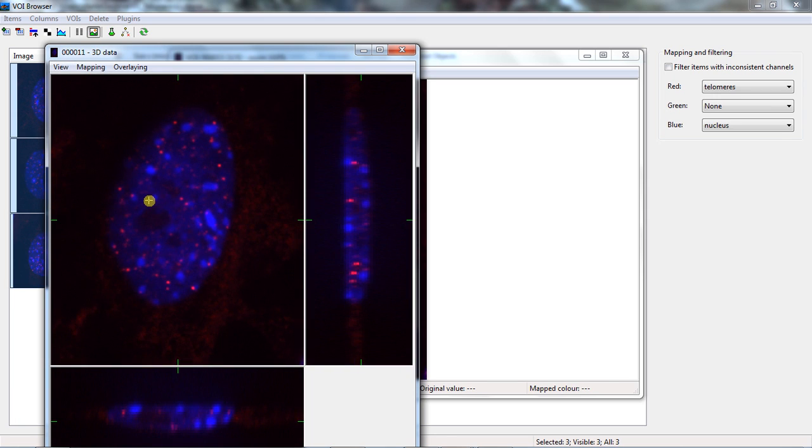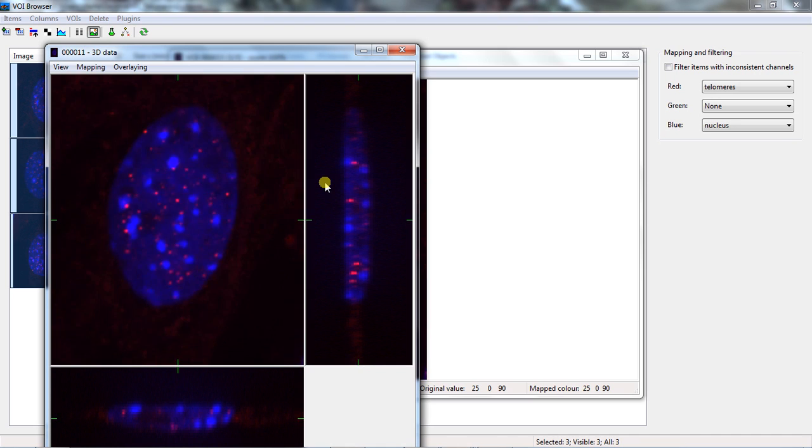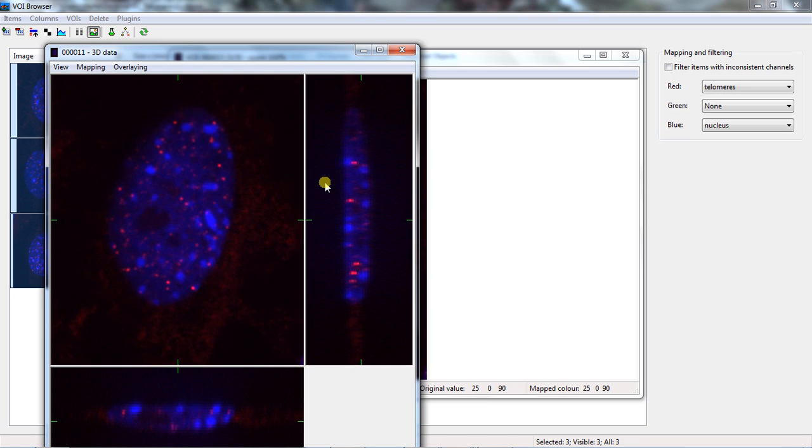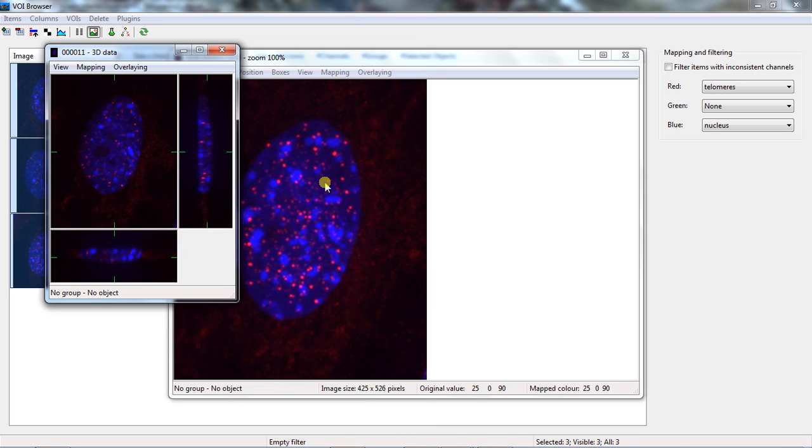You will find handy the Page Up and Page Down keys. They change the slice in the active view and enable you to go through the image volume. This is Page Up. This is Page Down. Even F2 and F3 keys zoom in and out as they did before. So this is F3, this is F2.